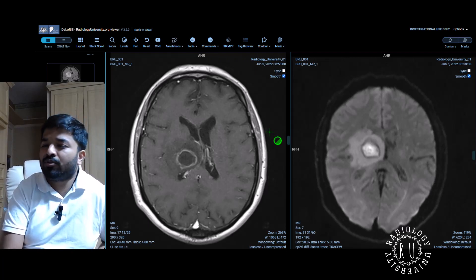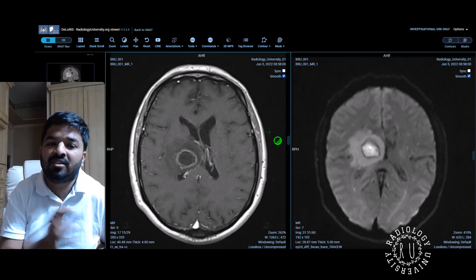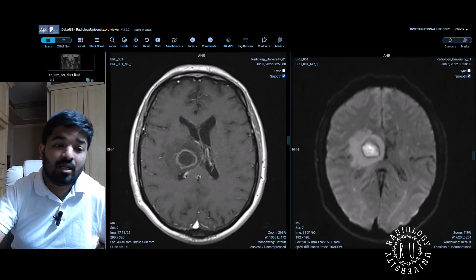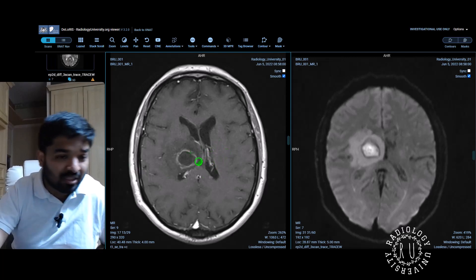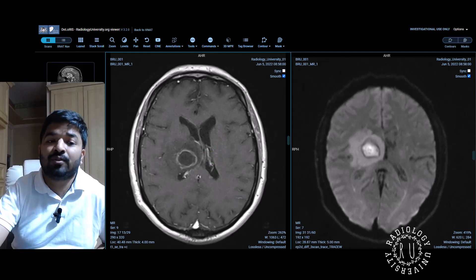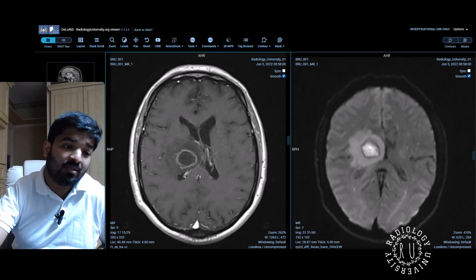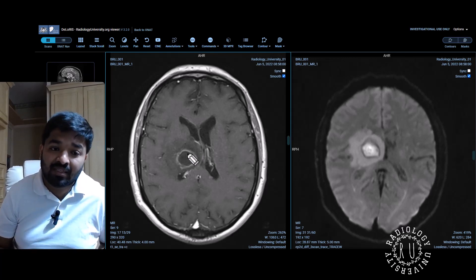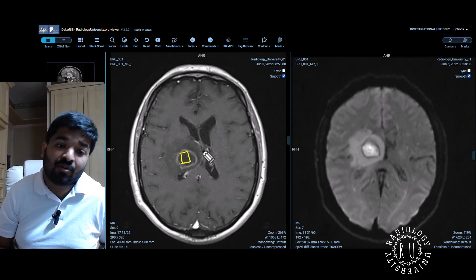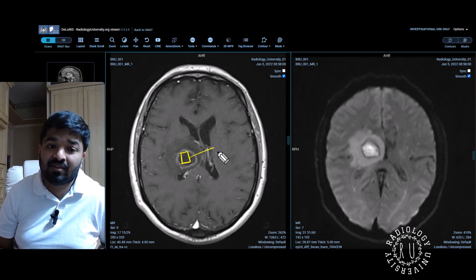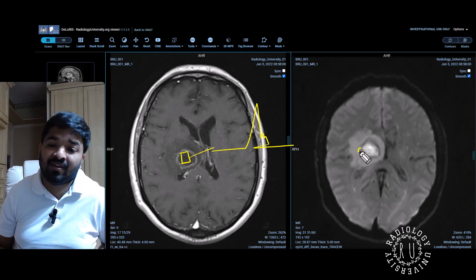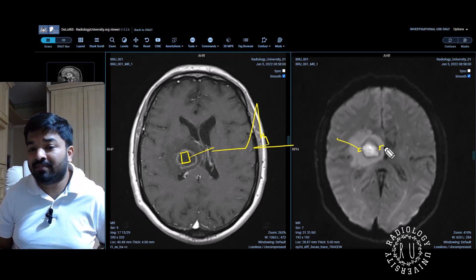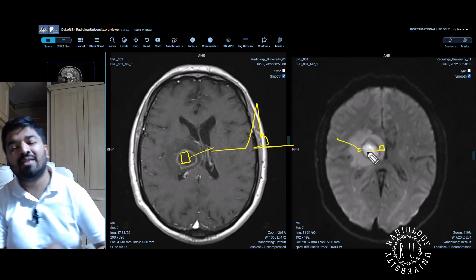What else could you do to confirm this is an abscess? You can do perfusion, which will not show increased perfusion. You can also do spectroscopy — with a single voxel that will suffice — and it will show a lipid-lactate peak. Some people mention that fungal abscess shows trehalose peak on spectroscopy, but that's not really needed for your exam.